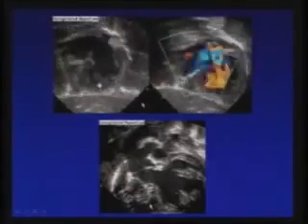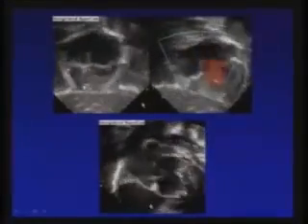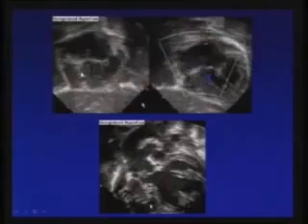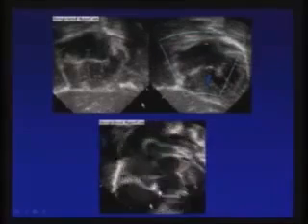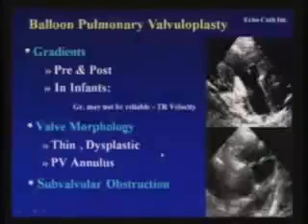This is echocardiography of a child with mesocardia. You can see how the heart is sitting in the central plane. So this is mesocardia with a large ASD. And inside, the child has truncus arteriosus. This is the LV, the truncus, and the pulmonary artery arising from the common trunk.